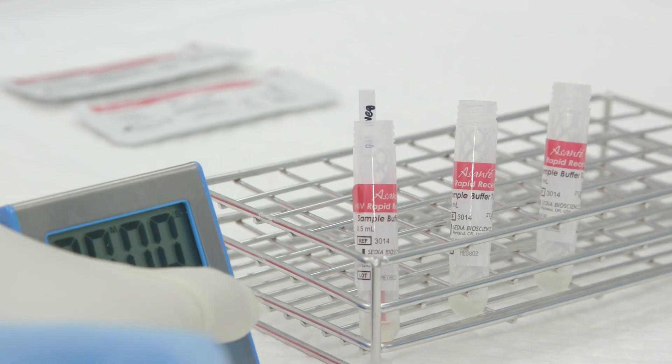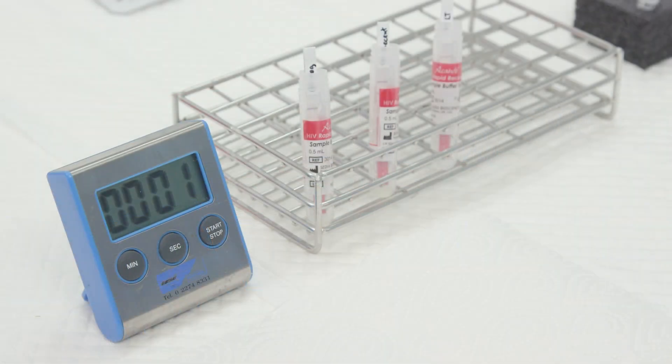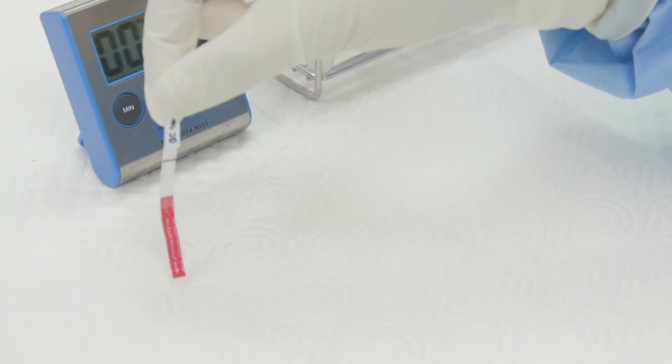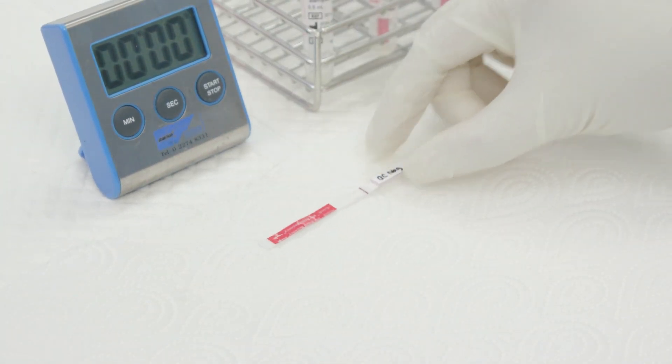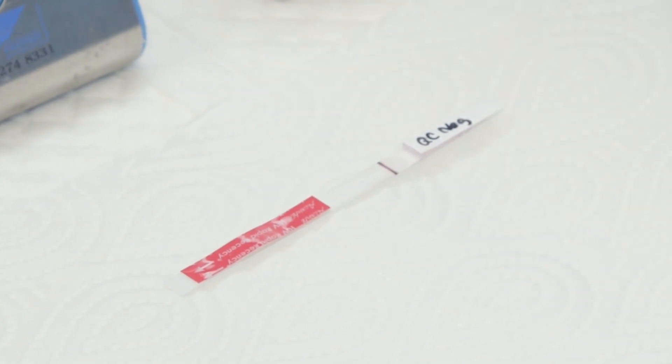Step 10: Start the timer and wait for 20 minutes. At the end of 20 minutes, remove the strip from the sample buffer. Step 11: Let the lower end of the strip that carries the buffer solution touch the paper towel to drain the excess buffer. Step 12: Lay the strip flat on the bench and read the result immediately.